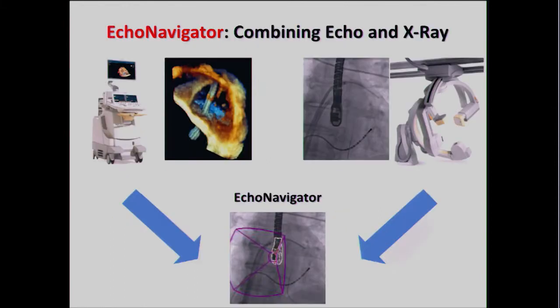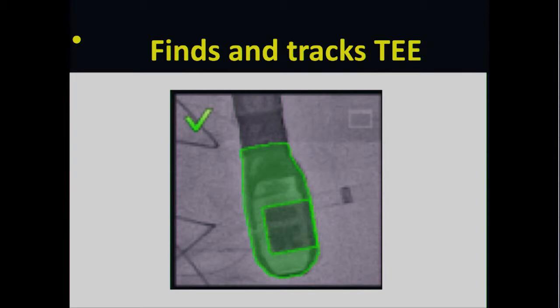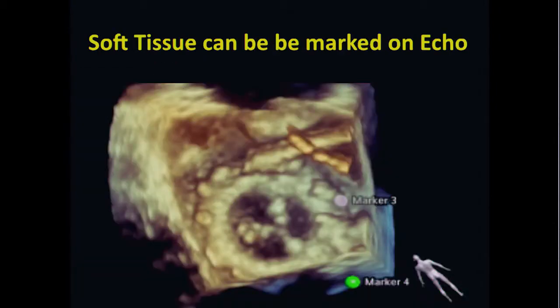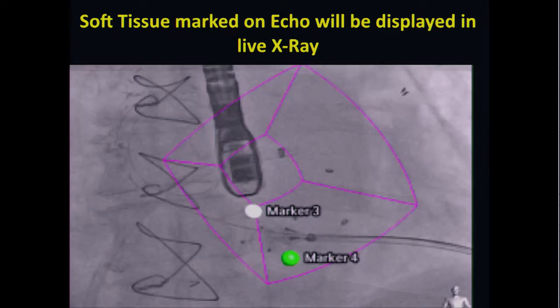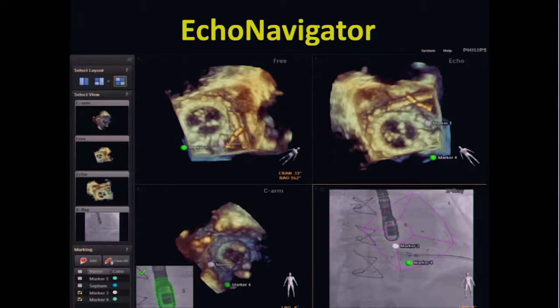Now I move on to the echo navigator, which means combining image fluoroscopy and echo. First we use transesophageal echo to detect the head of the transducer by fluoroscopy, and if we make a mark on the echo image, it automatically appears on the fluoroscopic image. When we move the camera angle, the marker automatically follows the anatomical position, making it very easy to select or find the position we want to see.